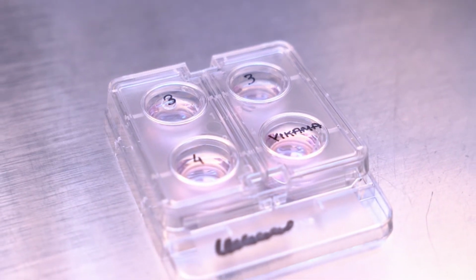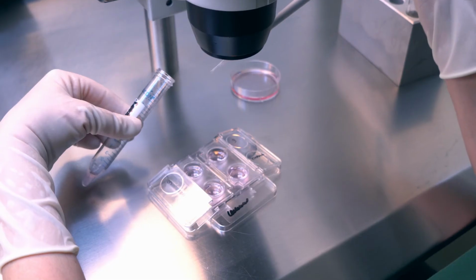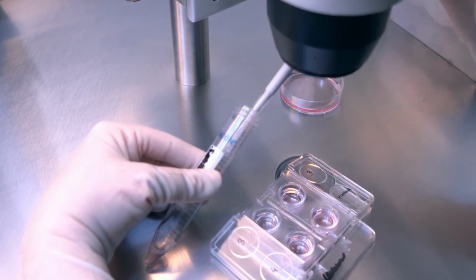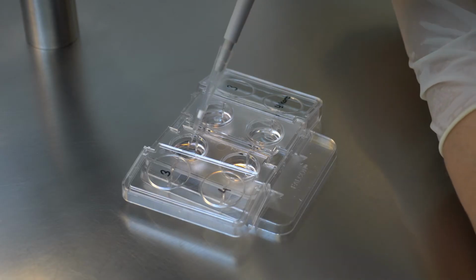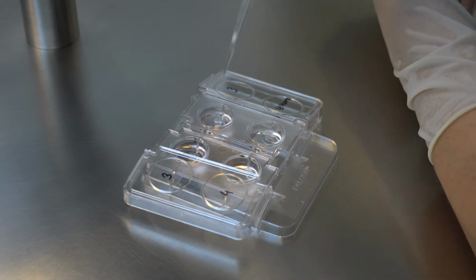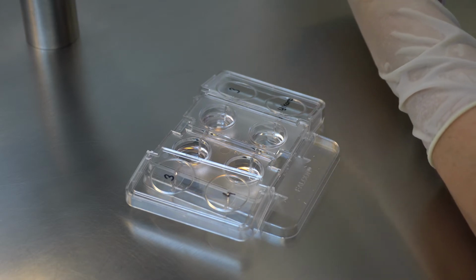One 4-well dish will be sufficient for every 10 cumulus oocyte complexes. In our practice, we place 3 cumulus oocyte complexes into the first 2 wells, and 4 cumulus oocyte complexes into the third one. The 4th well is used for washing.